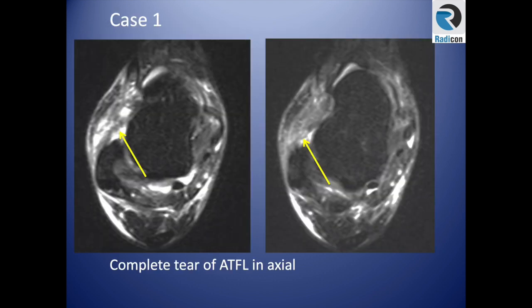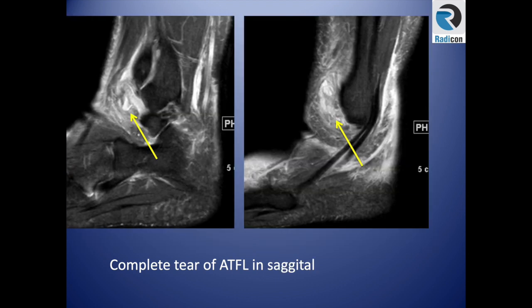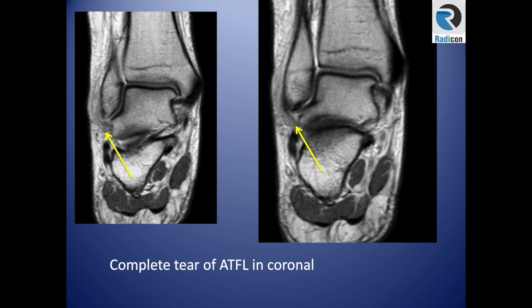Case one: looking at the axial image, the fibula has a coma shape, indicating we are at the level of the anterior talofibular ligament. There is severe attenuation of the anterior talofibular ligament with significant surrounding edema — an almost complete tear. On the sagittal view, we no longer see the nice band extending anteriorly to attach to the talus. On the coronal view, detachment of the anterior talofibular ligament from the tip of the fibula confirms this is a complete tear.